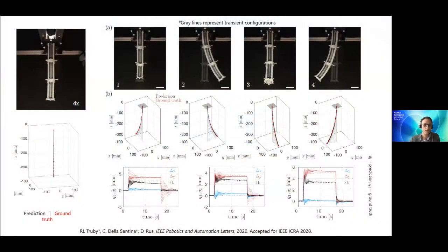and these are the results for very simple motions. These are in the validation set, they are not in the training set. What you can see in black is the output of our algorithm, and in red the ground truth coming from the motion capture system. You can see that the steady state behavior is actually quite good, while in the transient we have some kind of low pass filtering behavior, but still it's pretty good. You can see here the evolution in time in the latent space.